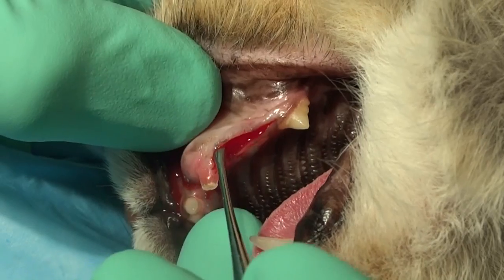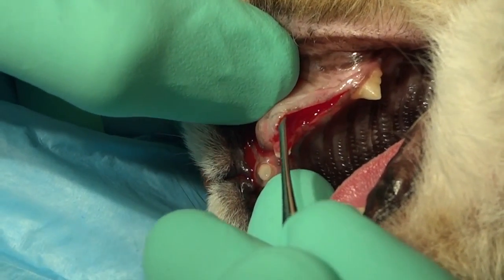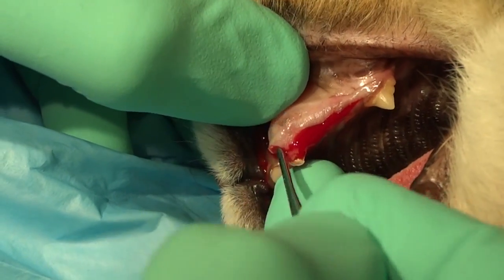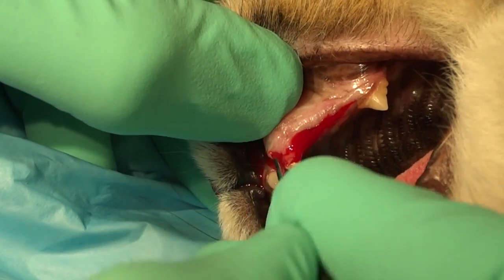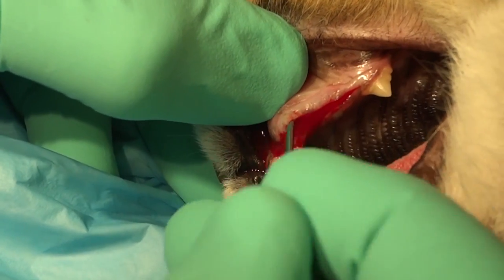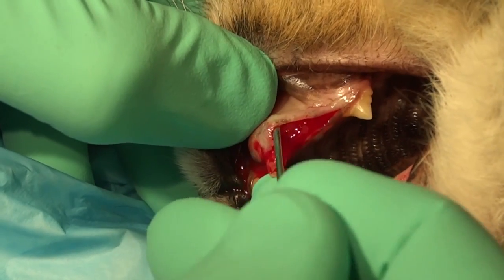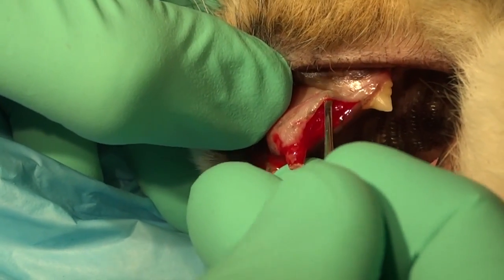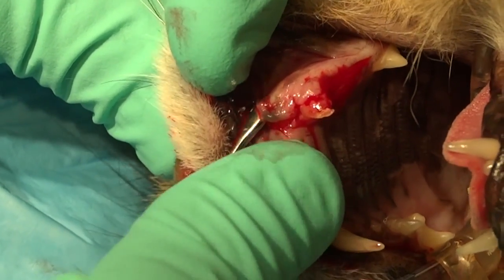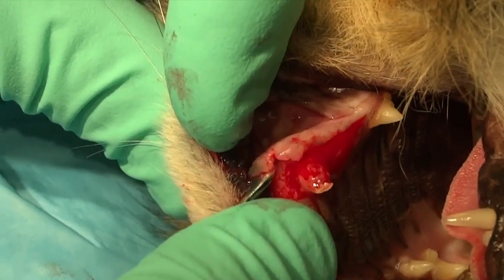You can see here we're using the small end of a feline periosteal elevator, and we're working the perimeter initially. We don't want to put a lot of pressure or focus on one area. We want to go around the whole perimeter, removing that attached gingiva to minimize the possibility of devitalizing that flap due to puncture. If we put too much pressure in one spot, the pressure on either side of that elevator is significant unless there's a perimeter that's been elevated already.